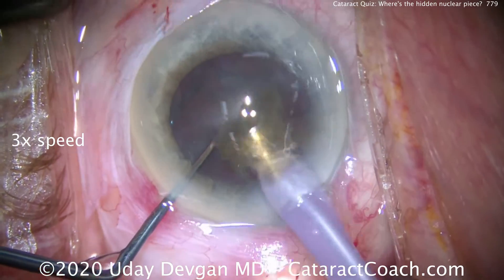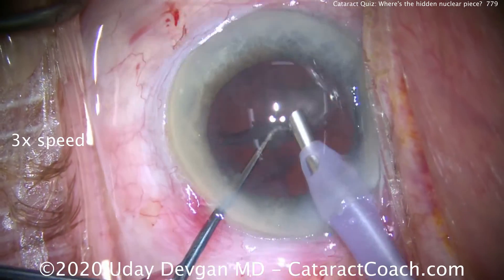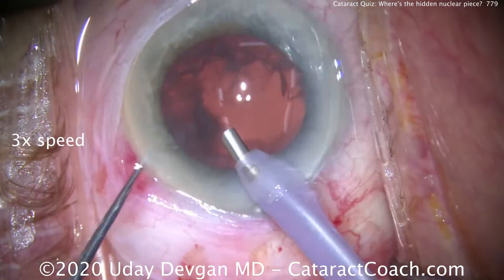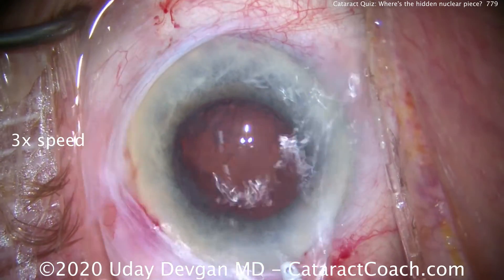We've recoated the corneal endothelium with dispersive viscoelastic, doing our best to protect those delicate endothelial cells. Here comes the remainder of the lens nucleus — looks pretty good. The epinuclear shell comes out pretty nicely.